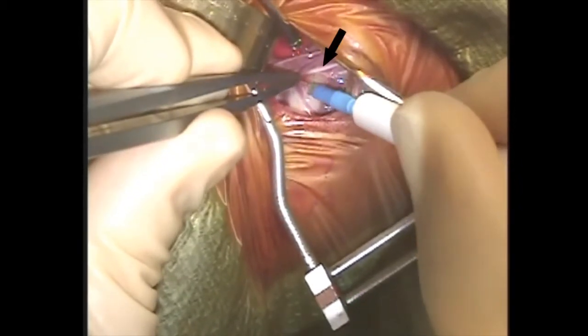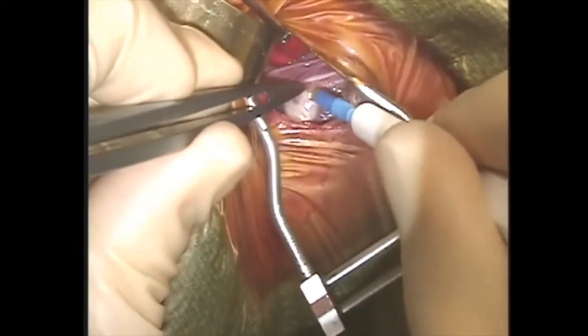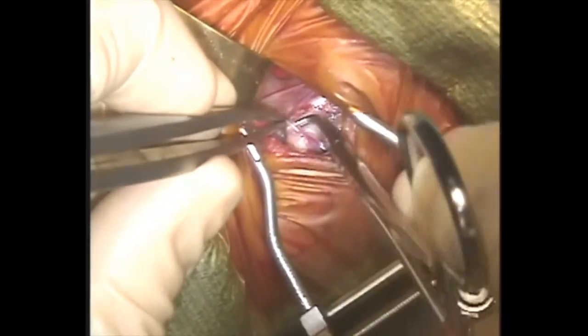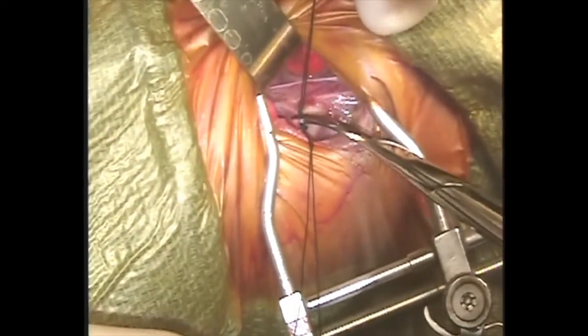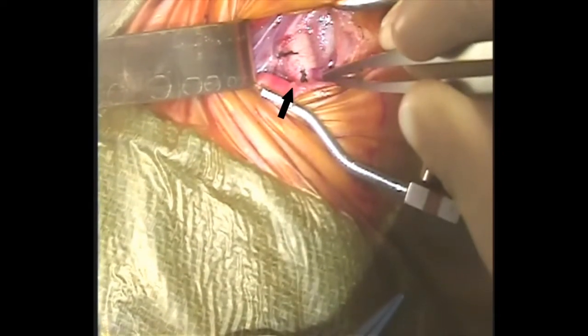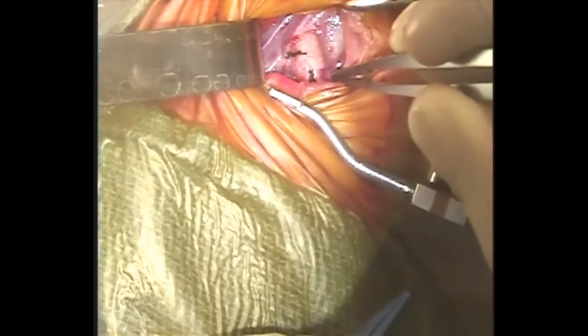The vagus nerve is seen just above the dissection and careful blunt dissection is continued. During this dissection, it is common to encounter small horizontal veins, which can be tied off. As you dissect the distal arch and the PDA, it is crucial to identify the descending thoracic aorta and the left subclavian artery to avoid inadvertent ligation of these structures.